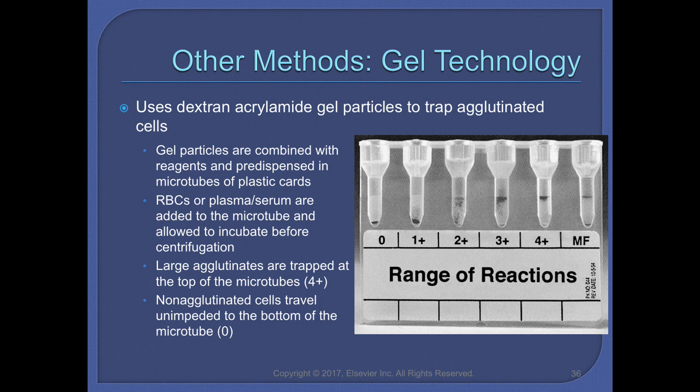With tube shaking, right? When we do a tube method, we have to do tube shaking to resuspend the red cell button. And these tube shaking techniques can vary among technologists. It could be an issue when you do tube testing, because I could shake a tube a little bit harder than the technologist working on the second shift. The reading can also be subjective, because what I see might not be seen by the person that's going to do the test after me.